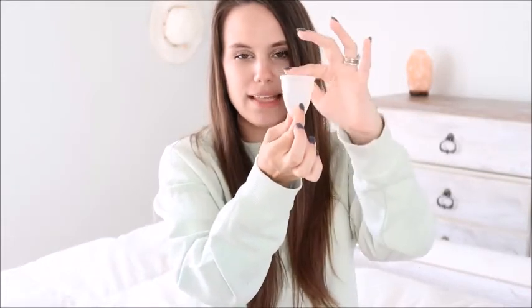I just bear down a little bit, and then I find the base of the cup and squeeze the base, because that will help break the suction, and then I just pull it out. When you pull it out, it doesn't slosh and go everywhere. It literally just sits in the cup. Then you dump it out in the toilet, take the cup to the sink and wash it out with soap and water, mild soap, not anything harsh, because you don't want to put that in your body.